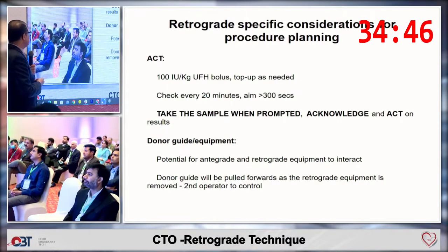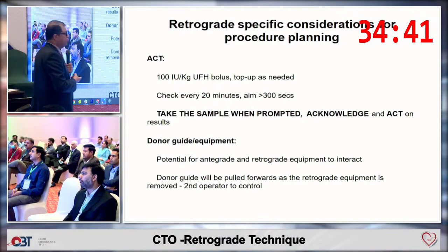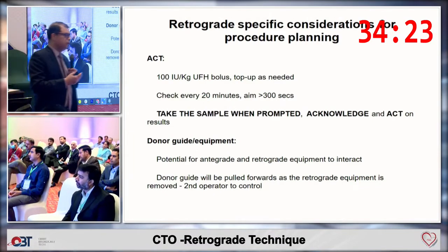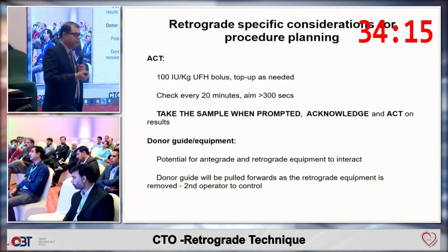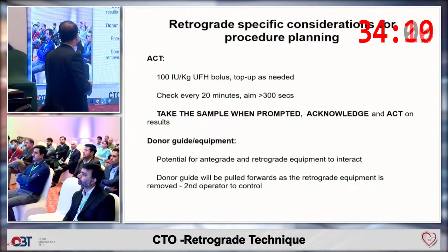So ACT is very important. Keep your ACT above 300 whenever you are doing a retrograde approach. Again, the point I was saying: whenever you are removing the retrograde equipment, the donor guide will be pulled forward. Always remember that bad things happen when you are pulling the equipment out. So be careful and always disengage the guide before you are pulling the retrograde equipment back.